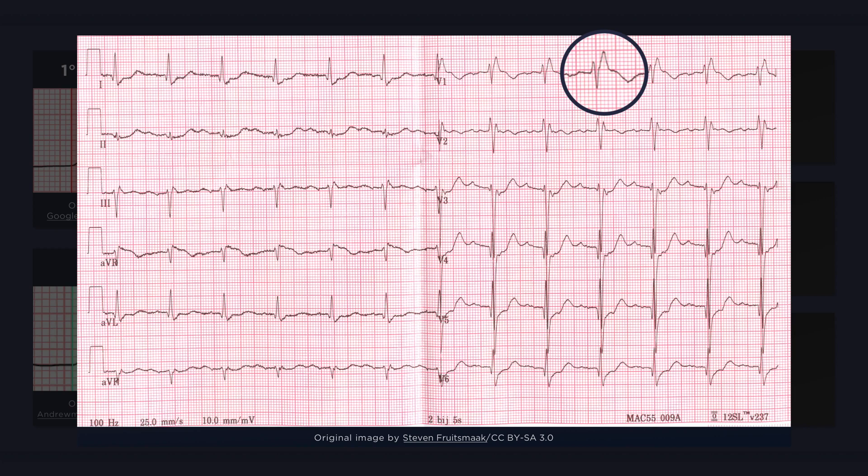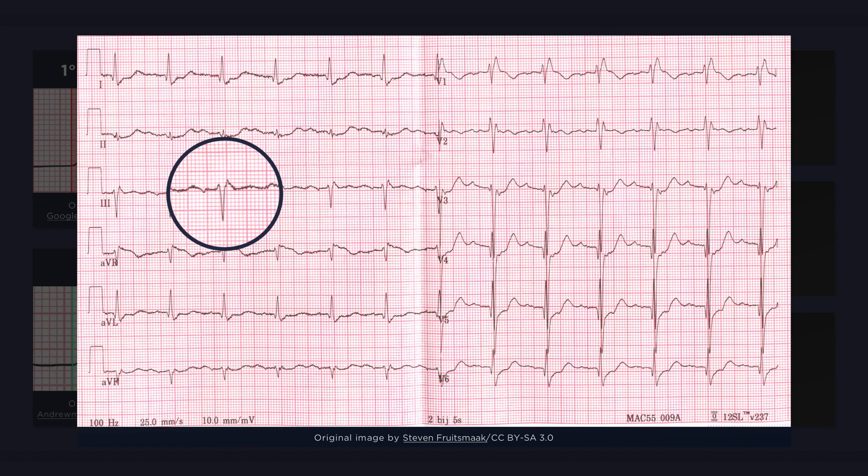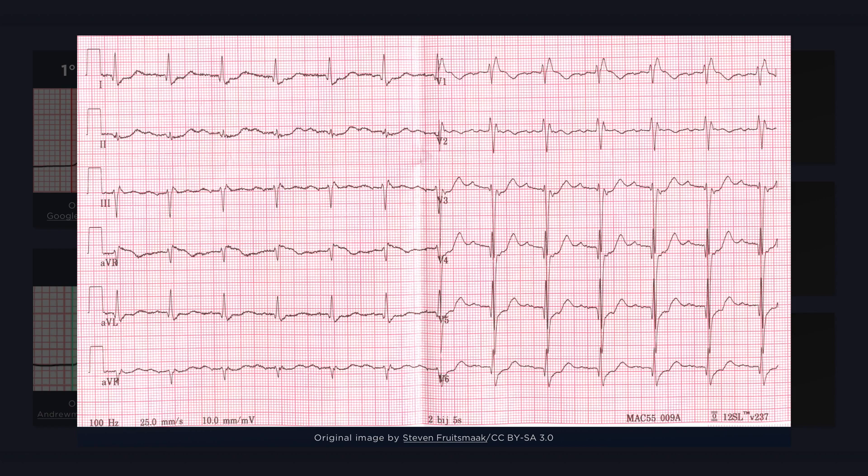In addition to the PR interval prolongation, there are also features suggestive of a right bundle branch block. Note the widened QRS complex with a bunny ear pattern in V1. And there's also a left anterior hemiblock. Note the left axis deviation and an initial R wave followed by a deep S wave in lead 3. I will discuss these other findings in subsequent lectures, but I'd like to briefly mention that the presence of these additional conduction abnormalities suggest that the defect resulting in PR prolongation may be located somewhere below the level of the AV node.